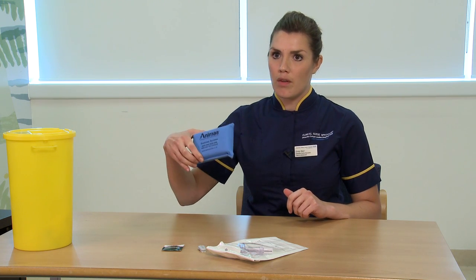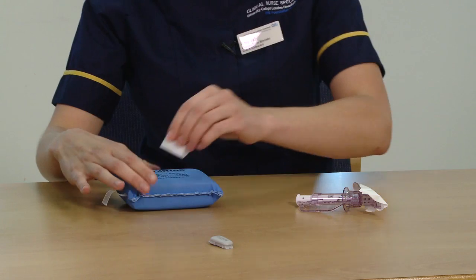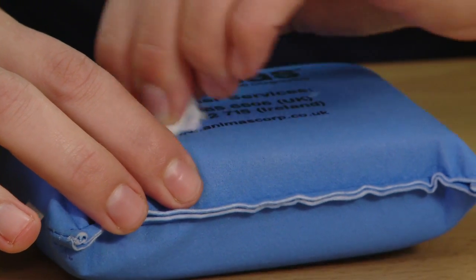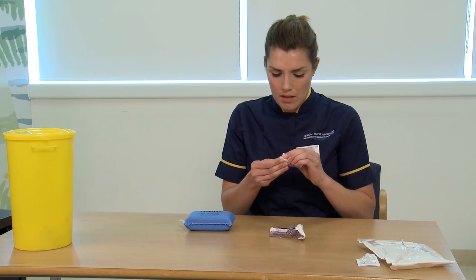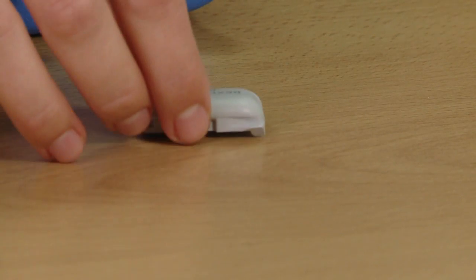The Dexcom sensor can be inserted into the abdomen and it needs to be done horizontally. I'm going to demonstrate on this demo pad here. The first thing I need to do is clean the area for insertion with an alcohol wipe to ensure that the sensor sticks. I also need to make sure that I clean the transmitter, as if it isn't properly clean it may not transmit fully.